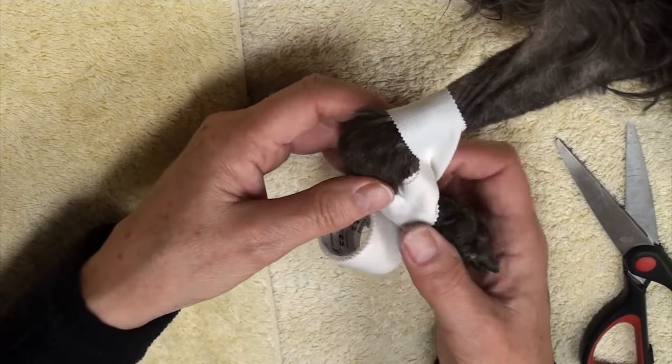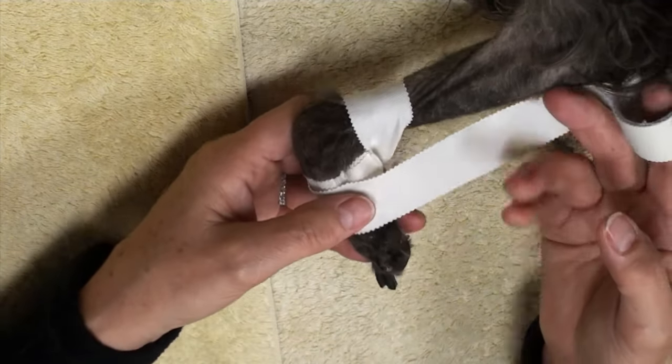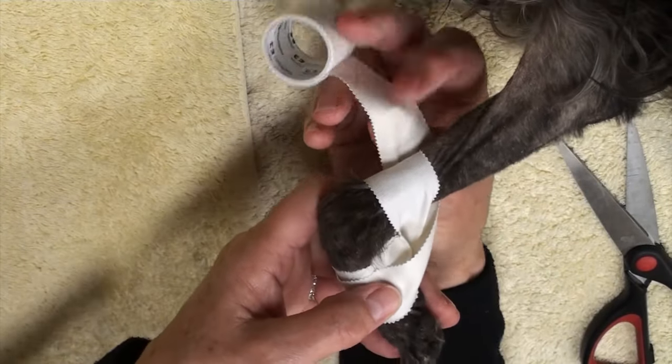Don't overdo it — it can be uncomfortable. And all you're doing with your tape is a figure eight style maneuver.